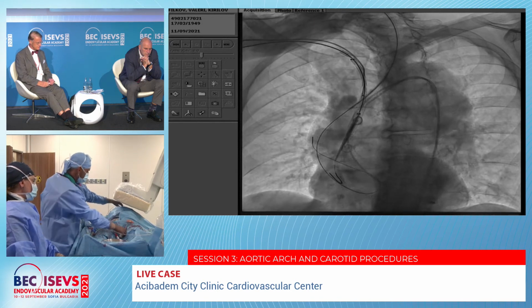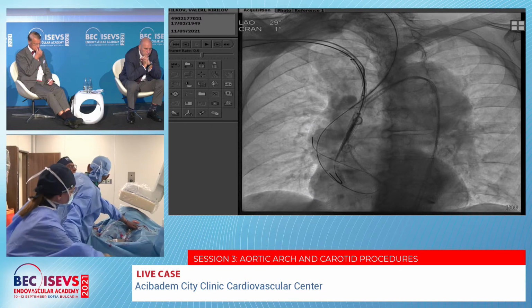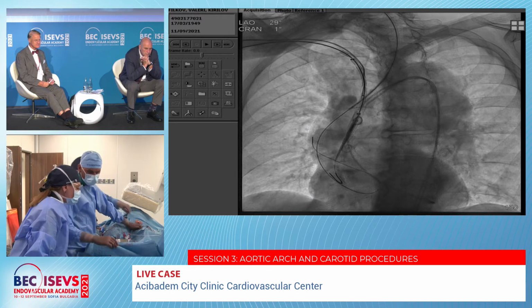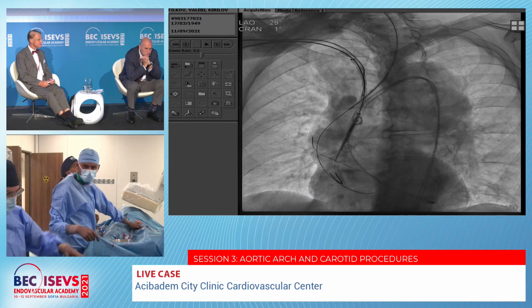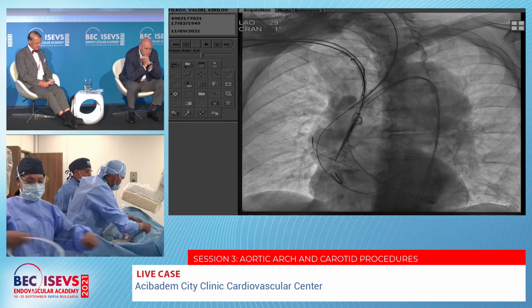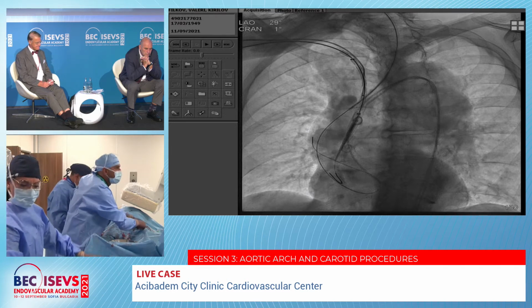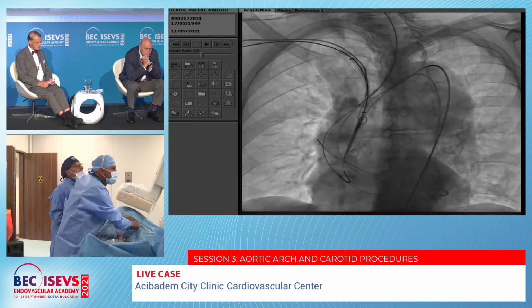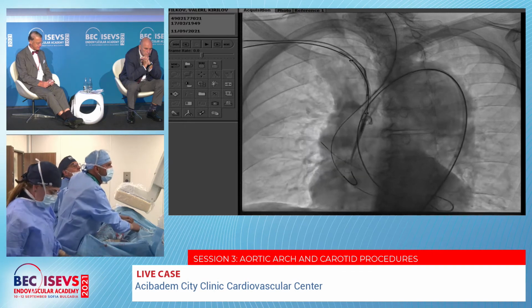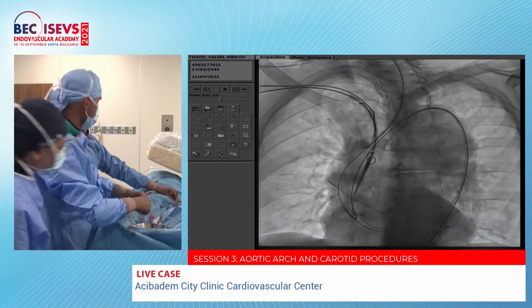Like that is probably not bad. We are going to make an angio. Okay, let's go. We are going to proceed now with the aortic graft. You probably saw that the Bentley graft is already there. The only detail that we have to decide is to retract it a little within the carotid, because we need at least 2 centimeters of the graft to be within the carotid in order to provide good sealing of the flow.